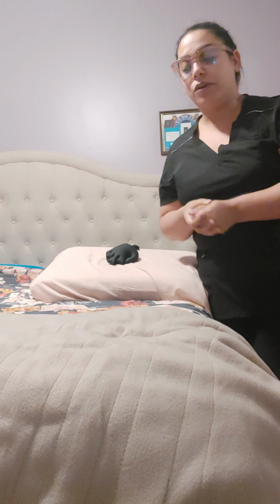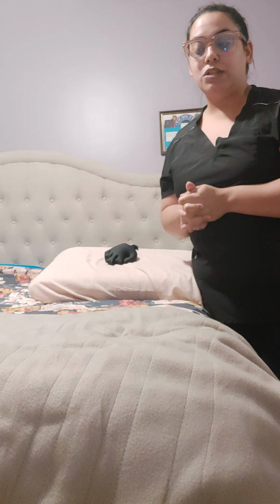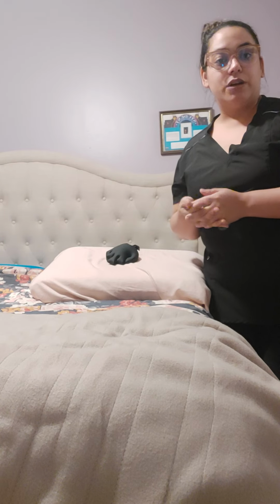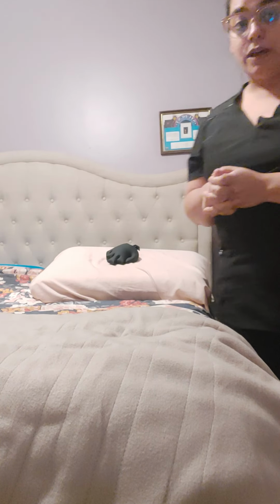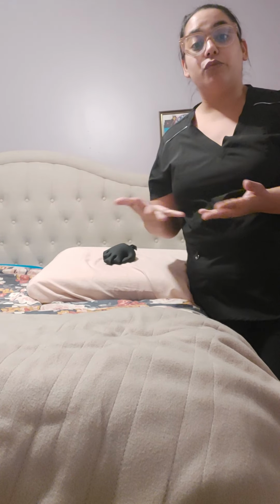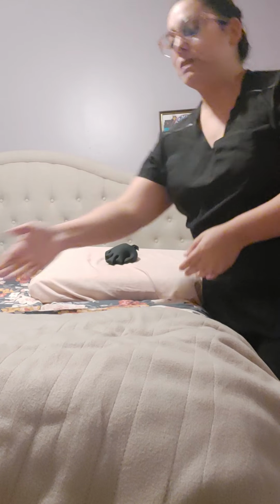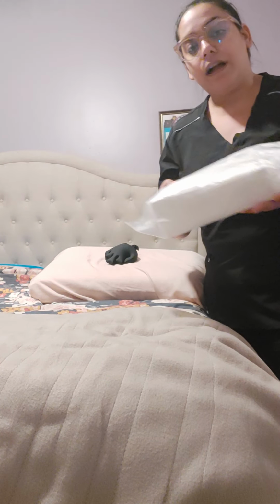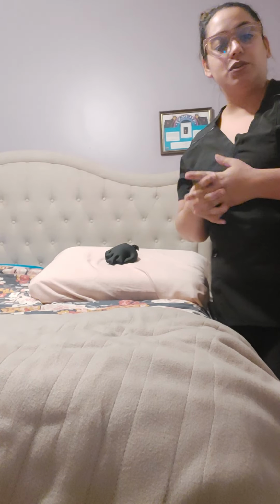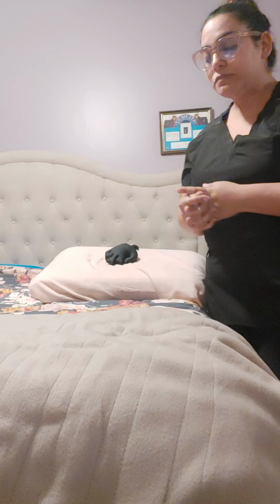This is Elisa Cordero. I am doing this video as my checkoff for the indwelling catheter insertion. Before I start, we would start out by making sure that we have an order for the indwelling catheter and a reason for it. Once I have obtained my order and my reason, I would gather my supplies, which I have right here. I would also grab an assistant, whether it be another nurse or a nursing assistant, to assist me during the procedure if need be.